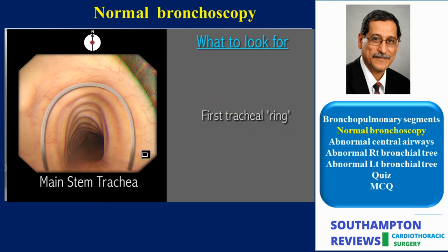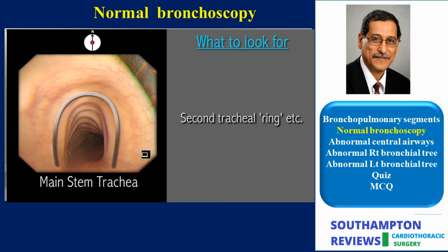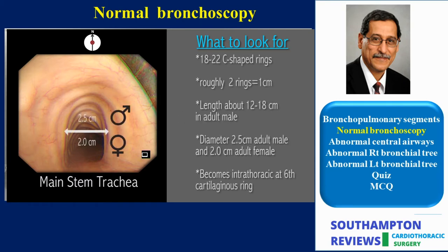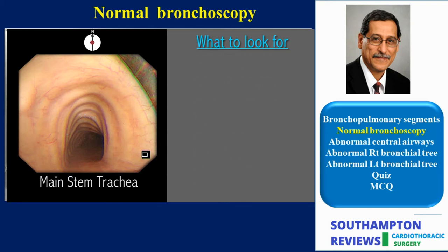The true trachea starts distal to the cricoid cartilage. The C-shaped tracheal rings are noted to dent the mucosa. In the adult there are 18 to 22 rings; roughly each two rings are equivalent to 1 cm, and the length of the trachea is about 12 to 18 cm in the adult male and shorter in the female. The adult male trachea has a diameter of 2.5 cm and the female a smaller diameter of 2 cm. This guide is useful when considering tracheal stent size.